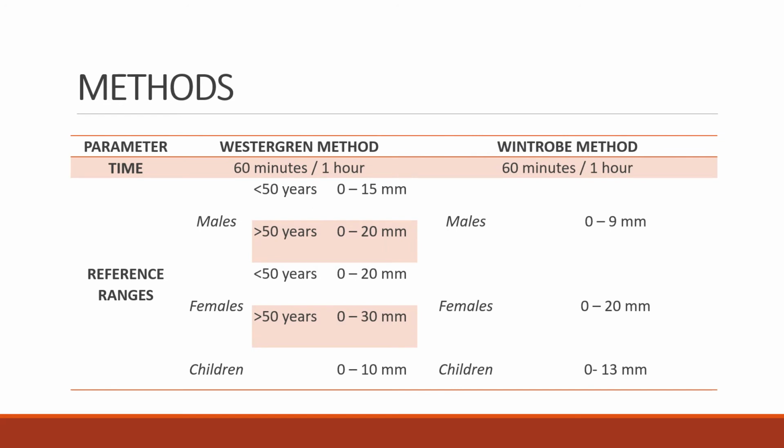The two methods of ESR can also be differentiated based on time and the reference ranges or the normal values. For the time, for both methods, there is no difference, because both methods require that the sample should stand for 60 minutes or 1 hour before reading the ESR result. For the reference ranges, we can differentiate both methods by looking at the patient population.